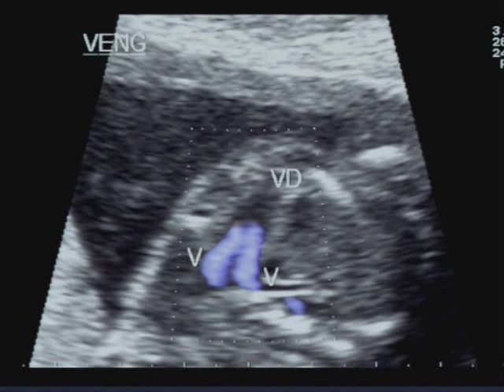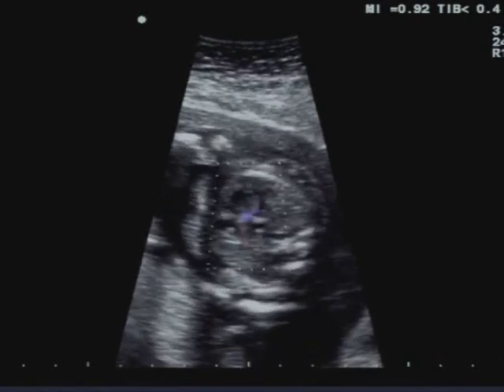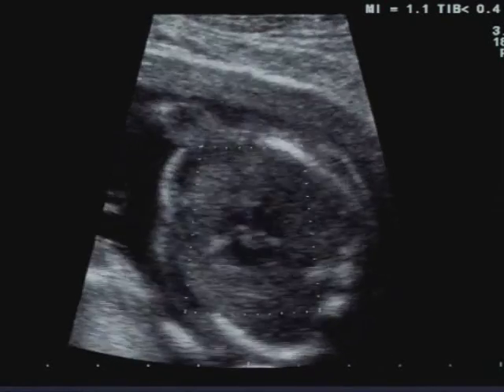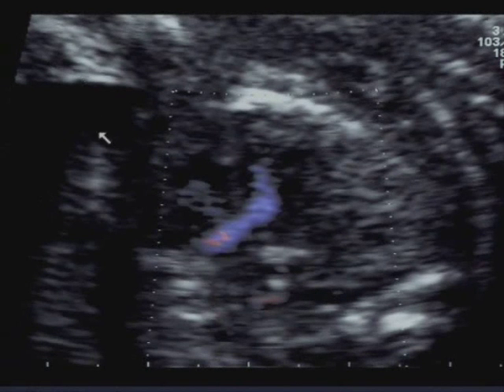The diagnosis of this condition is performed looking at the images on the scans of the long axis. In fact, double outlet right ventricle shows no signs of suspicion in the four chambers. In the long axis scanning, it shows the common origin of the great vessels from the right ventricle. Take another look at the ventricular septal defect with the filling of the left ventricle through the defect.